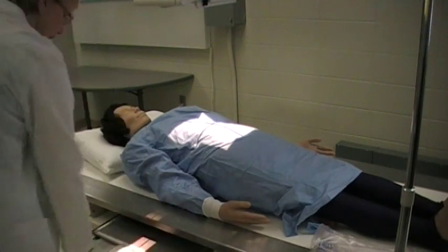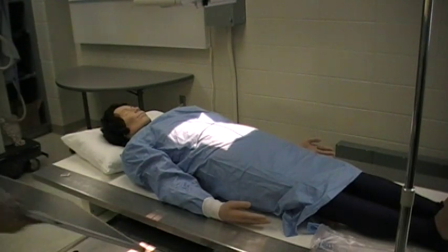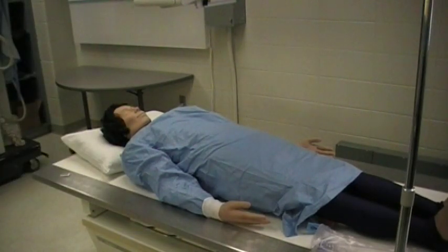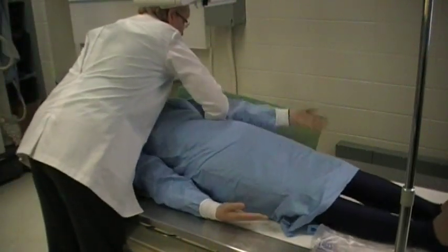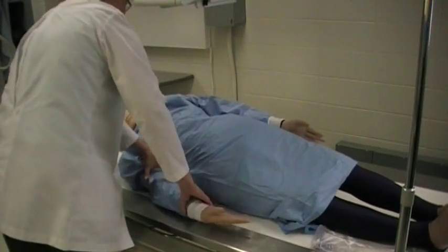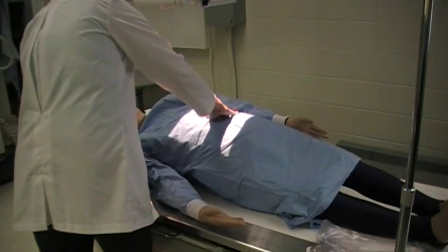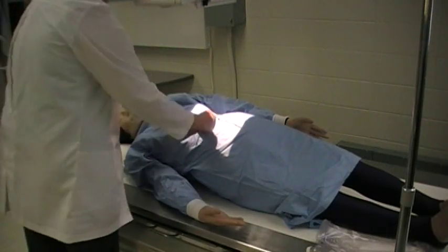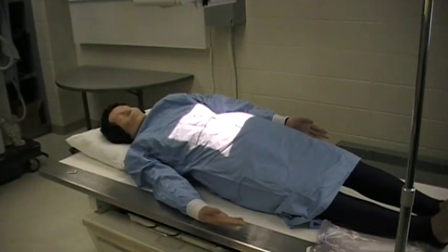The next will be the AP oblique — I'll be doing the RPO next. Your patient will be at an angle of 25 to 45 degrees. I'm going to use a positioning sponge to help the patient stay at the proper angle. A lot of patients can just hold this angle, so if that's the case you will not need to use the sponge. Find the crest — your longitudinal line will be one to two inches on the upside of midline.